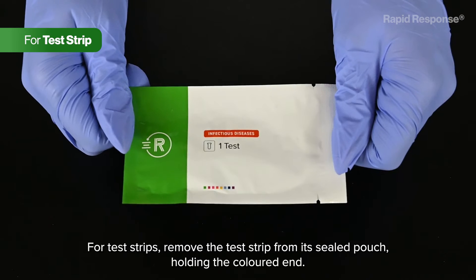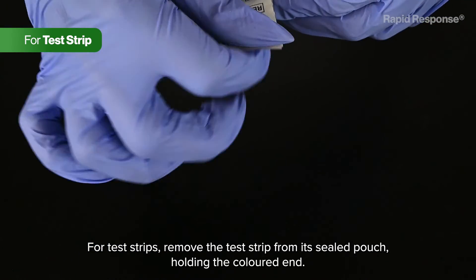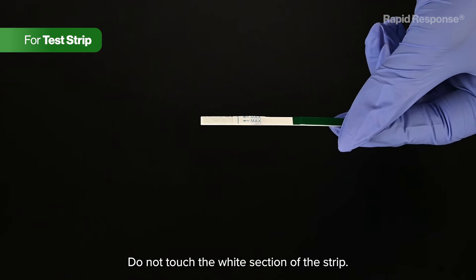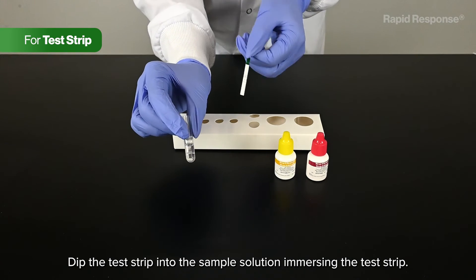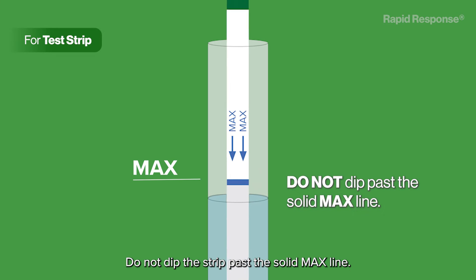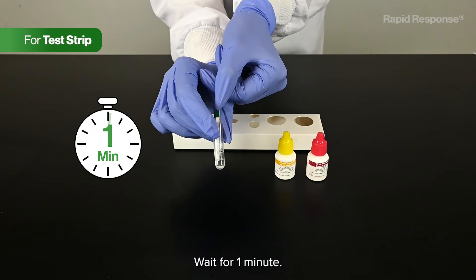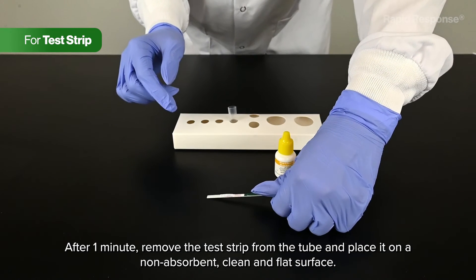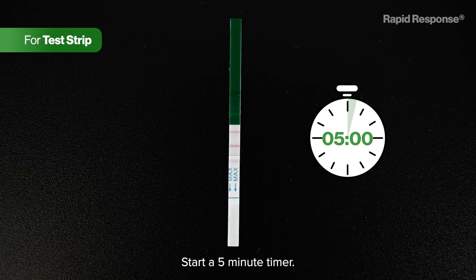For test strips, remove the test strip from its sealed pouch, holding the colored end. Do not touch the white section of the strip. Dip the test strip into the sample solution, immersing the test strip. Do not dip the strip past the solid max line. Wait for one minute. After one minute, remove the test strip from the tube and place it on a non-absorbent, clean and flat surface. Start a five-minute timer.